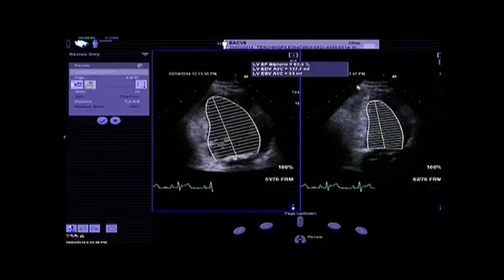And with the 2-chamber view, you can see that the biplane ejection fraction is 62%, meaning that we are still in the good normal range of ejection fraction in this kind of patients. But to be honest, I would have expected to have at least 70%, because 62% in presence of mitral regurg is maybe already a sign of some degree of LV dysfunction.